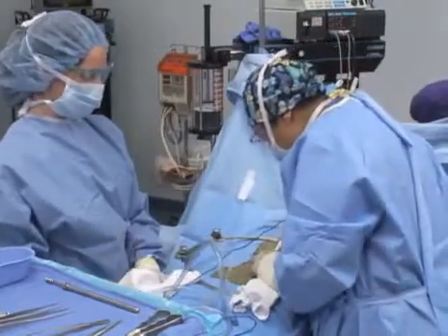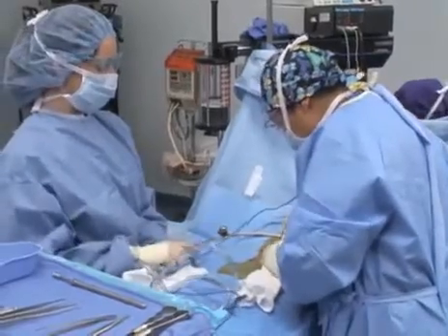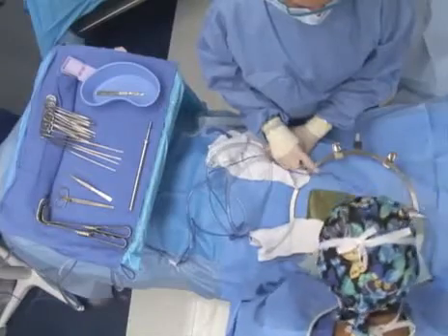Once the patient is draped, the center of the sterile field is defined. Draped tables and equipment are moved into position close to the patient, and scrub team members work within the sterile area.